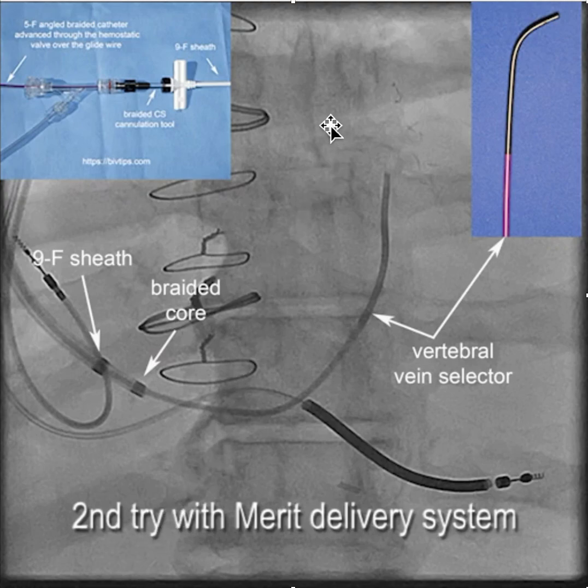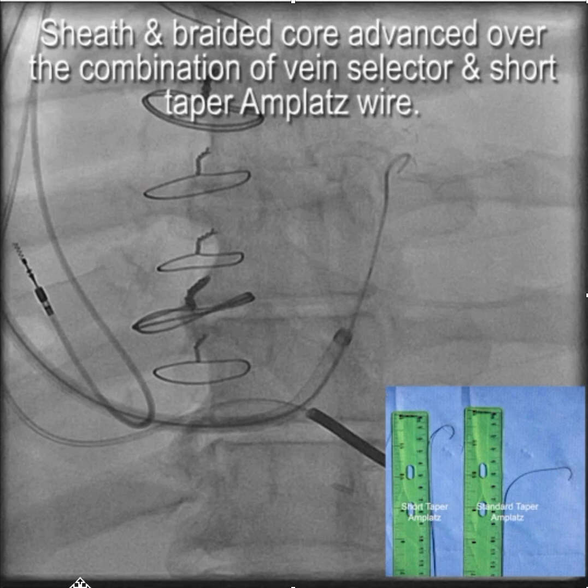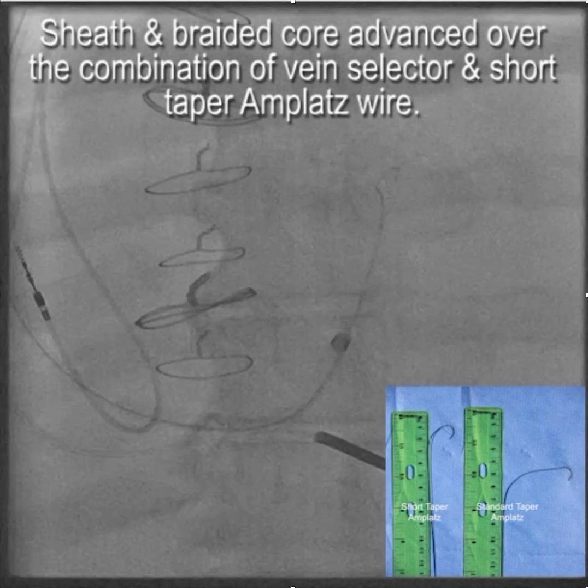This is the second time, now using the standard Worley CSG with braided core. Because the patient's creatinine was high, we were trying to minimize contrast. We got the vein selector — the vertebral vein selector — deep into the coronary sinus and took a look to see what was going on. We then put an Amplatz wire into the vein selector and slid the braided core and sheath over the combination of the vein selector and short taper Amplatz wire, giving us a nice stable situation from which to work.